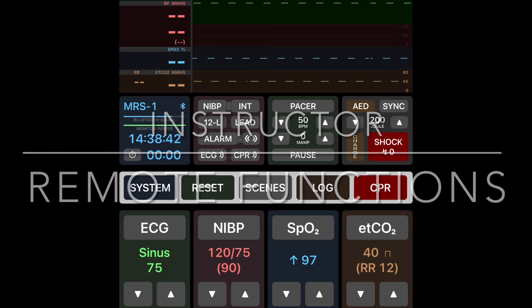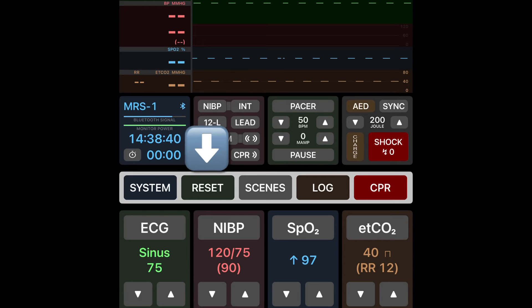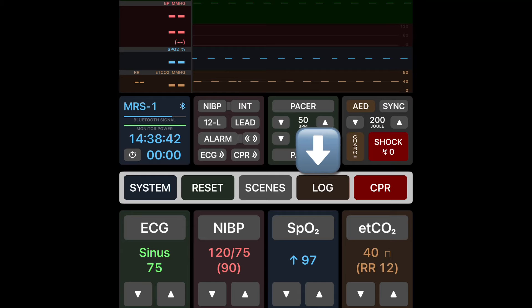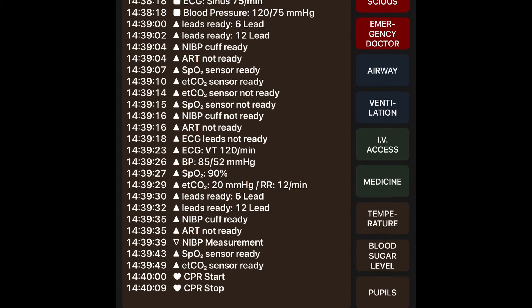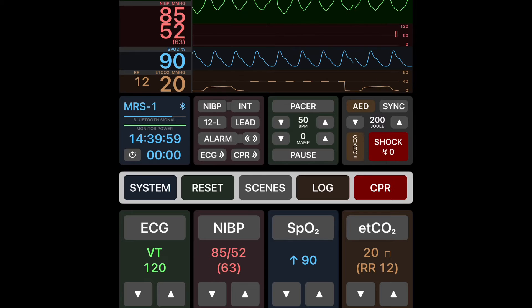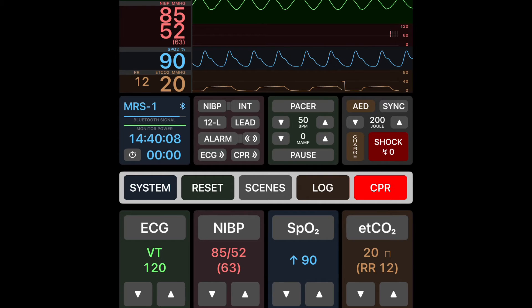Now let's take a look at the instructor remote functions. This is seen in a portrait view where the top portion of the screen is a replica of the student's display and can be controlled from the instructor remote. Down the center of the display are five buttons: the system button which allows the instructor to change settings, the reset button which allows the instructor to reset all settings, the scenes button which we'll talk about later, the log button which shows a display of all buttons pushed and gives options to add different events as the scene progresses, and finally the CPR button which when depressed during a code will hide the underlying rhythm and display a CPR waveform at an appropriate rate.